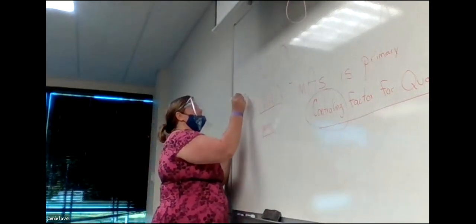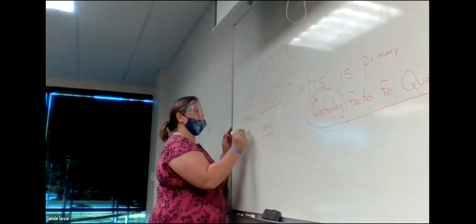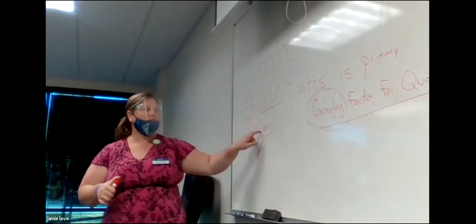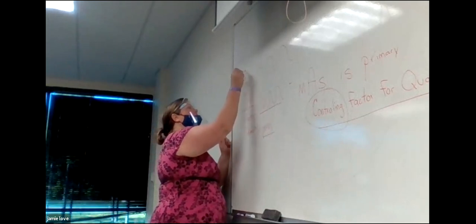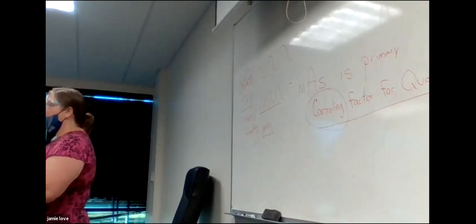So an increase in kVp affects quantity. If you increase kVp, you're increasing the number of photons just because we are changing our beam penetration, our energy level of our beam. Because kVp controls our energy or our penetration of the beam. How much energy are we going to have those photons come out with? Higher kVp, higher energy.